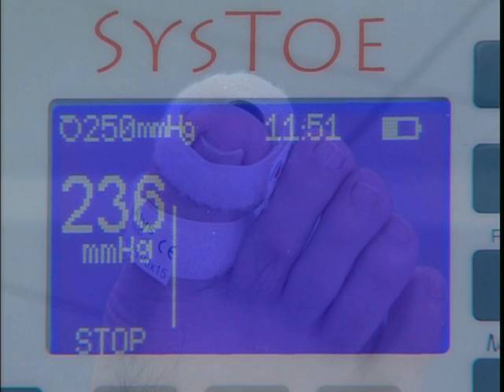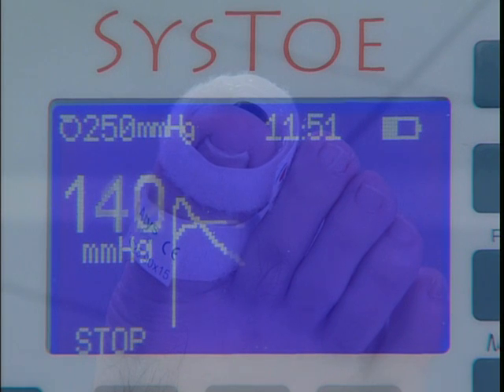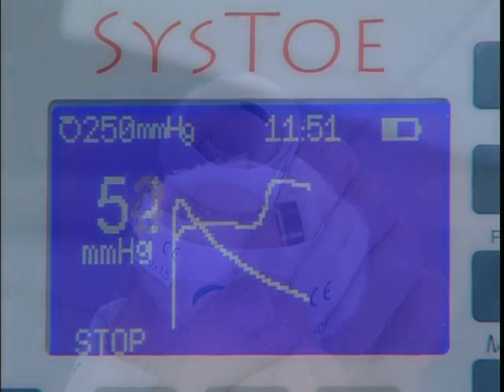Once the target pressure has been reached, the cuff automatically deflates at a steady rate. The Cysto precisely measures the cuff pressure at which arterial blood flow resumes, as detected by the sensor. This is the systolic blood pressure.